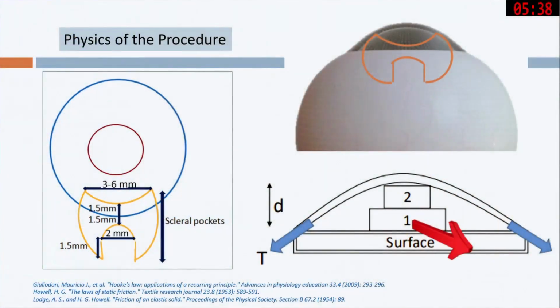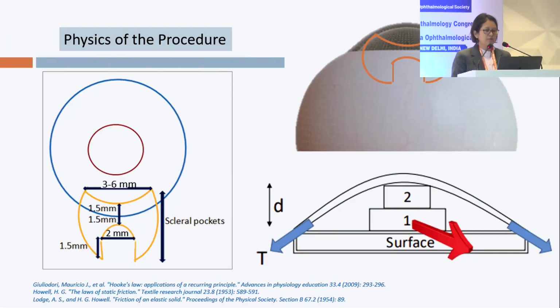As we all know, we are looking at 2 mm incisions, but I would like to say that this is an advanced MSICS technique which has 2 mm curvature on your scleral incision only, but then you need to place 2 parallel incisions on either side of the 2 mm, which will help you to create the pockets once you enter the cornea. So with this algorithm, I am showing you this schematic diagram.